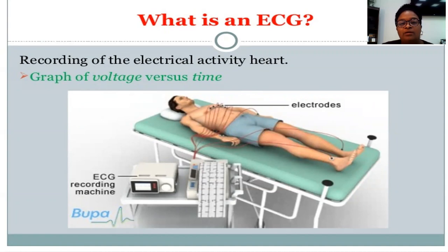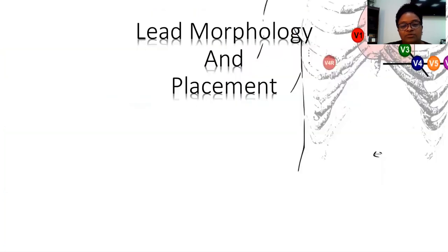So let's talk about what an EKG is. Your EKG is a recording of electrical activity of the heart by way of electrodes. Okay, so we're going to look at lead morphology and placement.